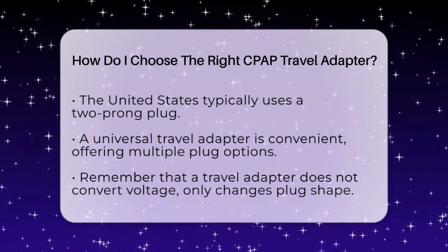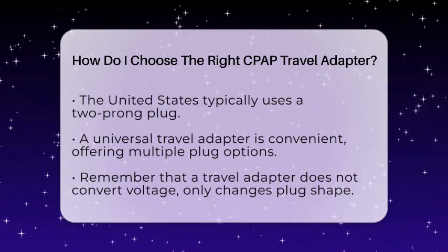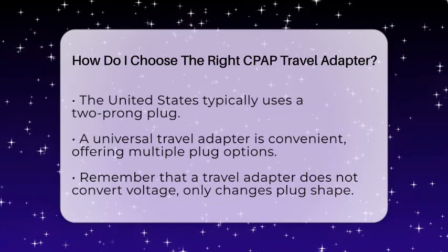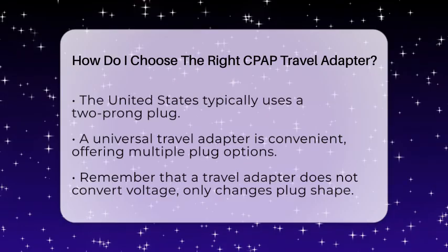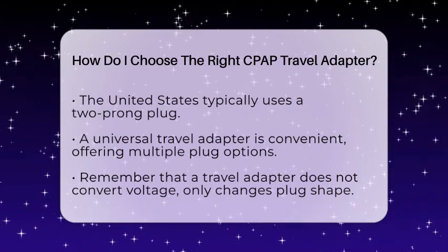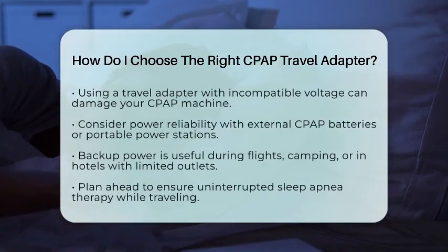Additionally, consider power reliability while traveling. External CPAP batteries or portable power stations can provide backup power when outlets are unavailable or inconveniently located. This is especially useful during flights, camping trips, or in hotel rooms where outlets may be far from the bed.